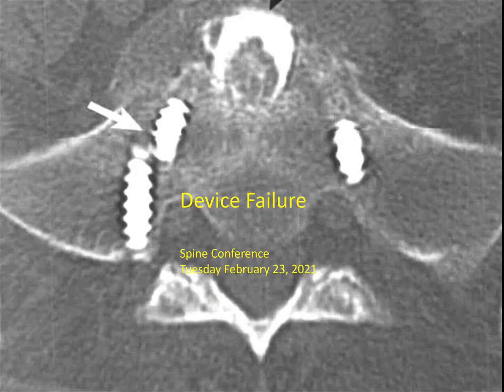Today's conference will be on spinal instrumentation device failure, and this is a different format where I have just one other person in the room, Dr. John Antonitis, who's not a spine surgeon, but he is an orthopedic surgeon. Great to be here. All right, it's like those podcasts.